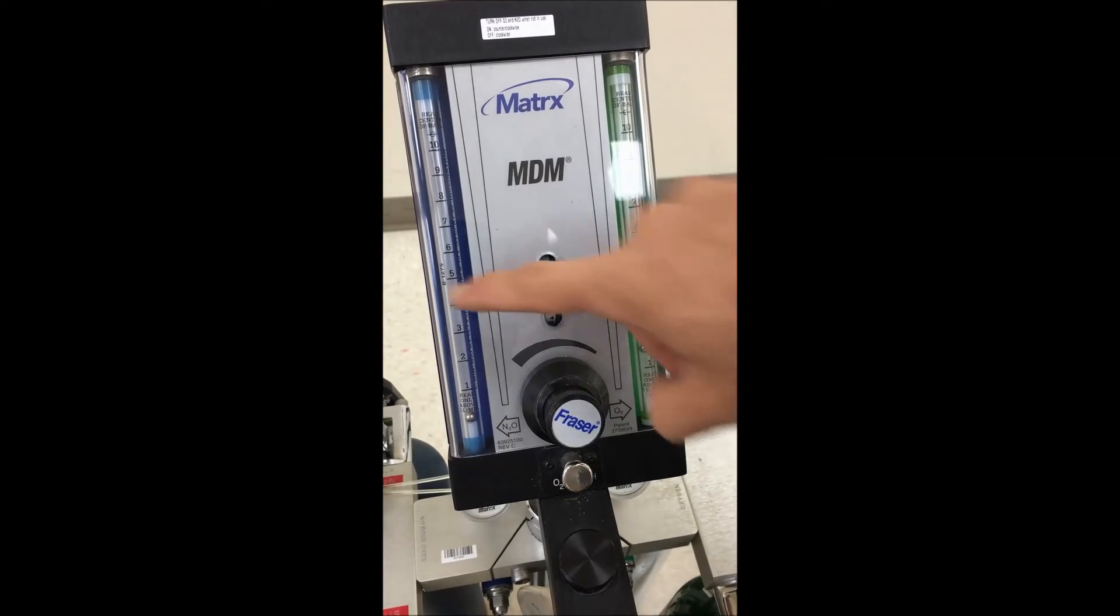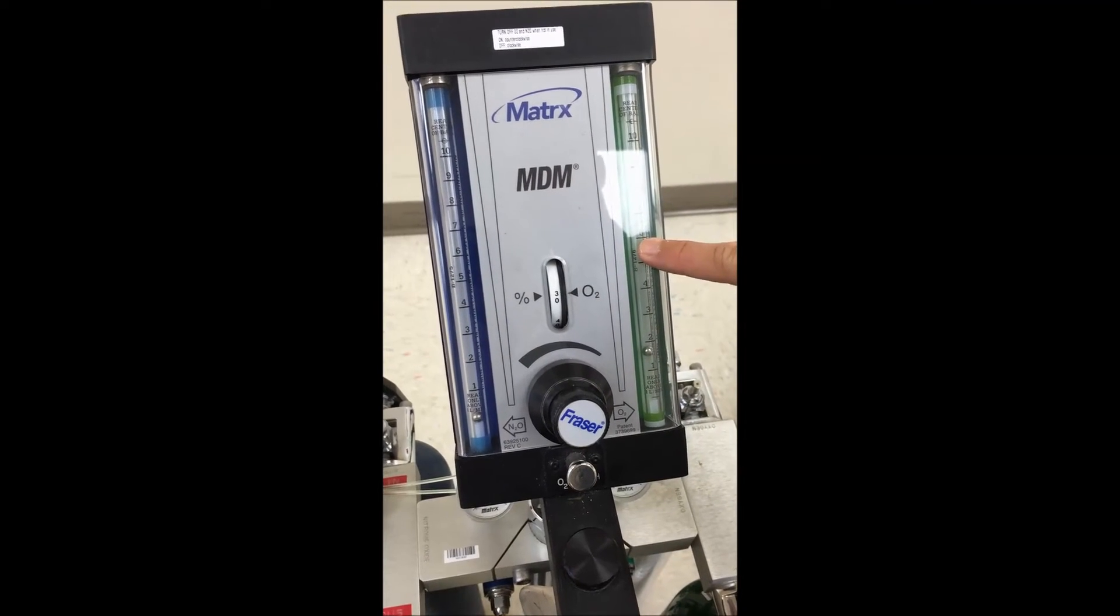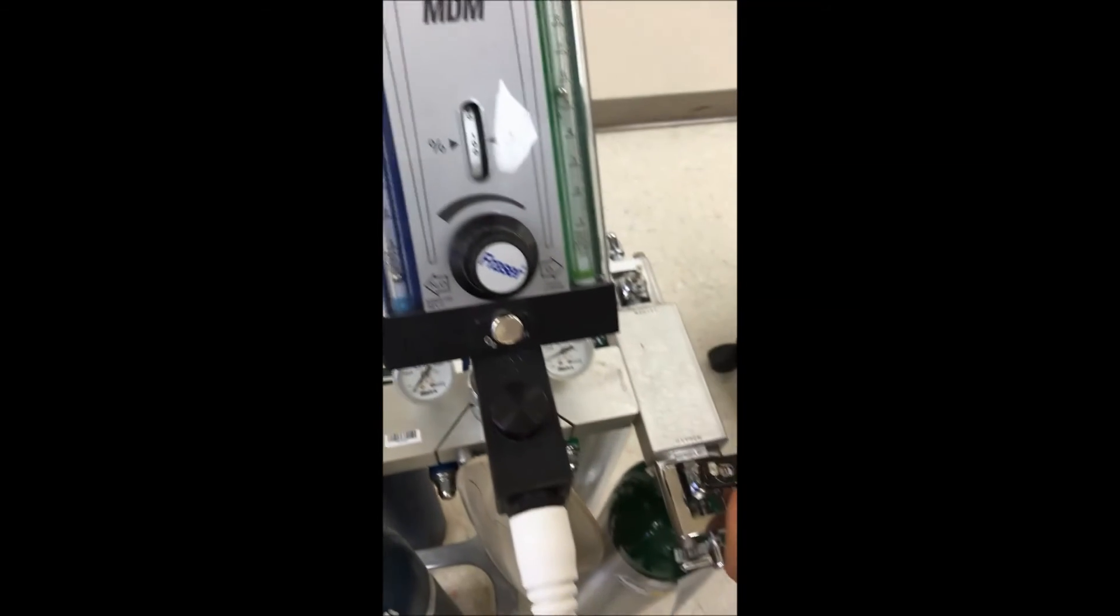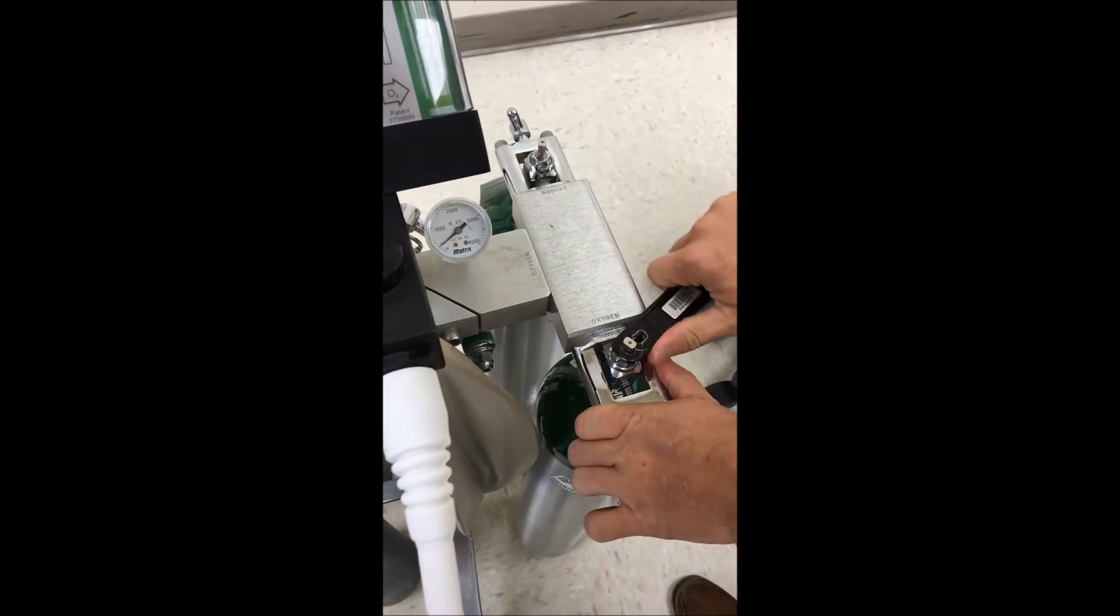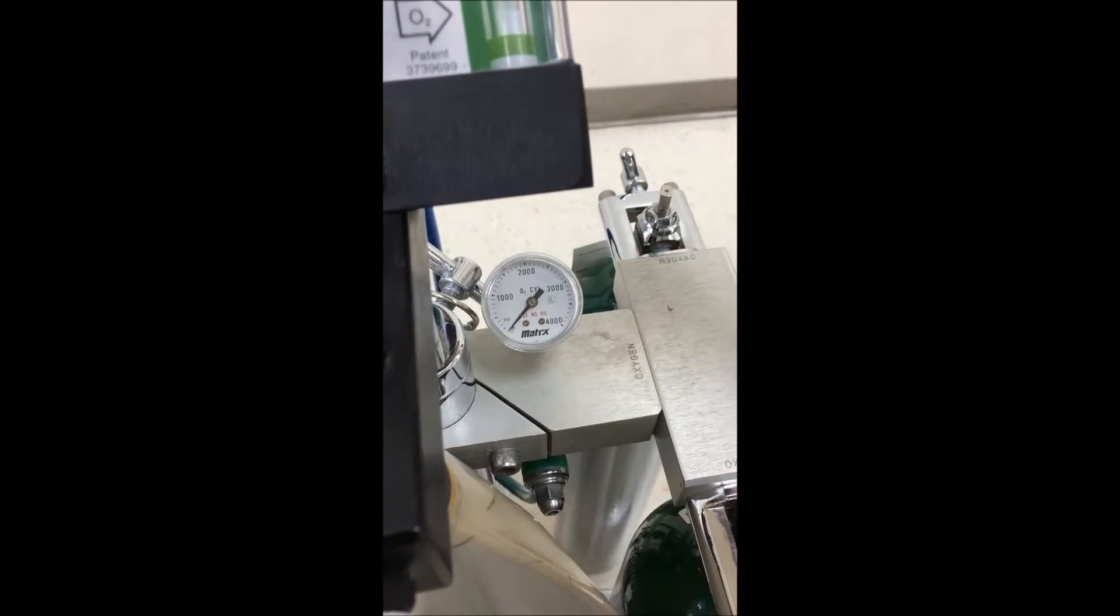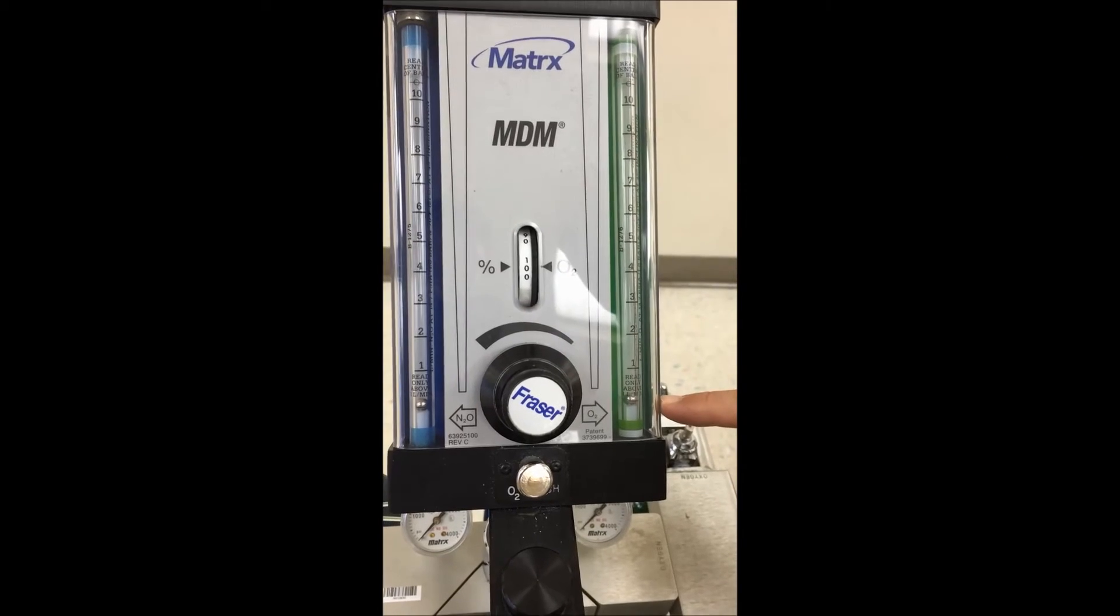So now that we've done the nitrous side, we're going to purge the oxygen. You can jack it up to 100%, turn off the tank, and it will go down to zero. When it's totally done, it goes down to zero.